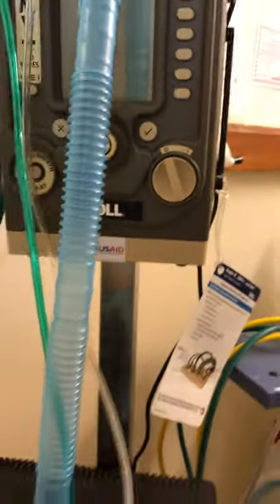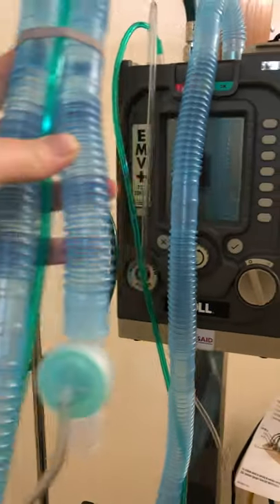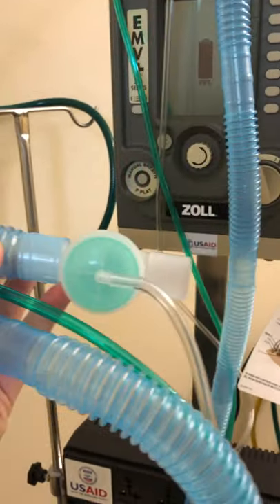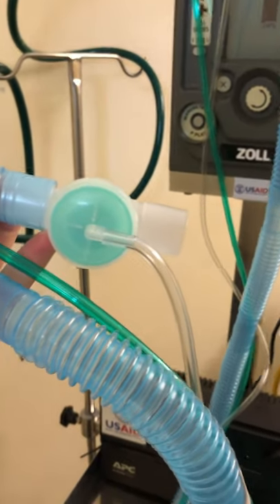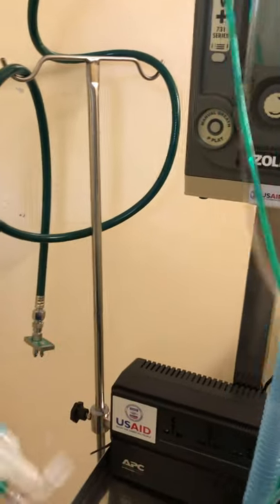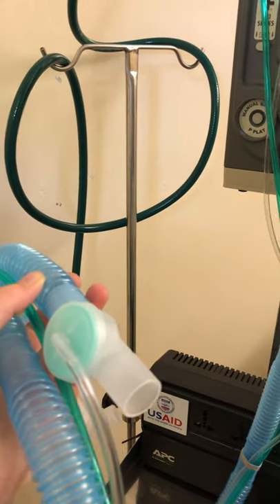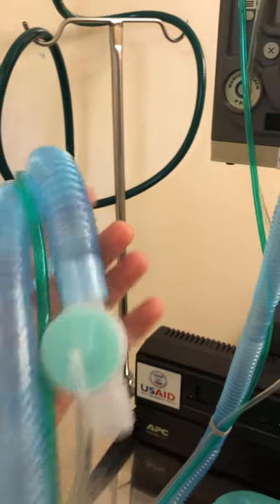The patient tubing for this machine is different than what we're used to. It's a tubing with an implemented expiratory valve. This expiratory valve is very important — it regulates the patient's breathing in and out, so if it's not working, your patient will not be breathing in or out. Make sure this end does not get blocked. Don't hide it under the sheets. Keep it always clear. If this breaks, you need to dispose of the tubing and get new ones.